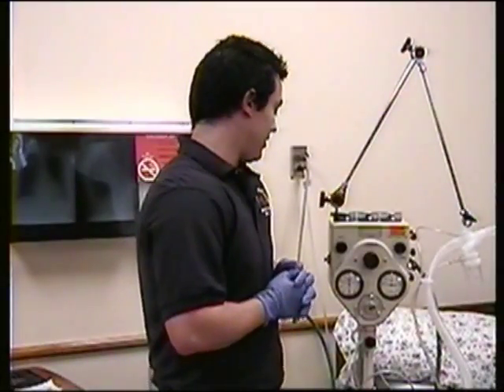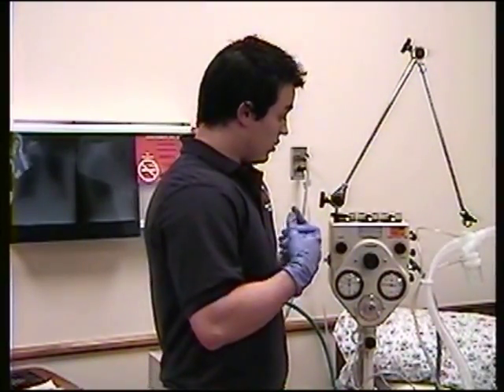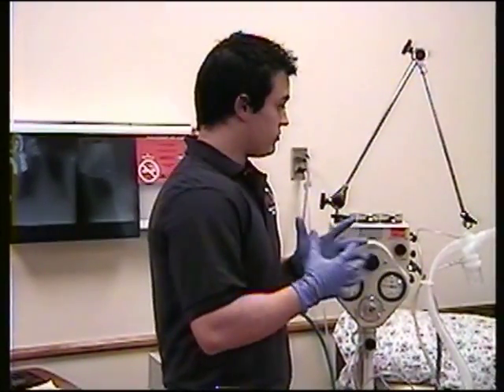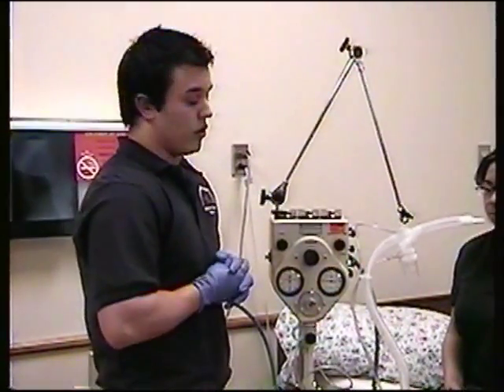IPPB. IPPB therapy is a lung expansion therapy that is going to expand the lungs. It's usually used with medication, whatever your physician has ordered.